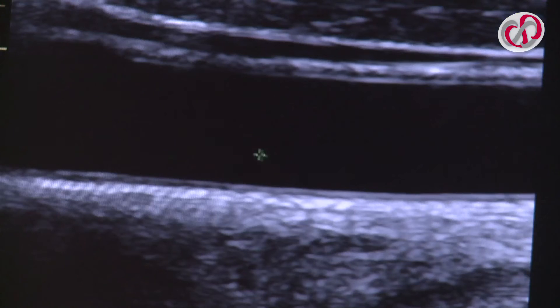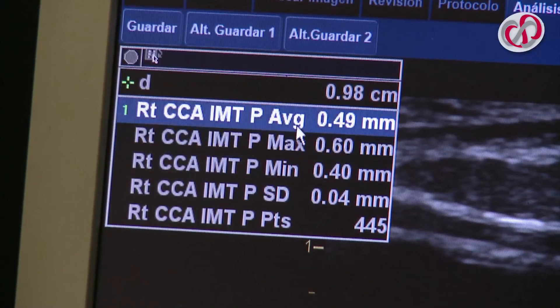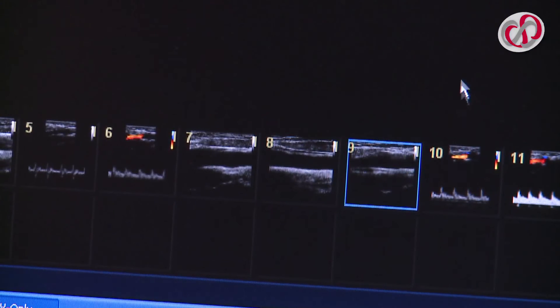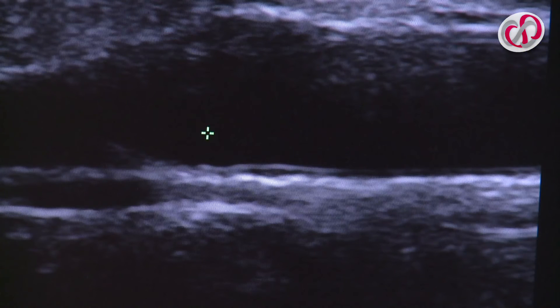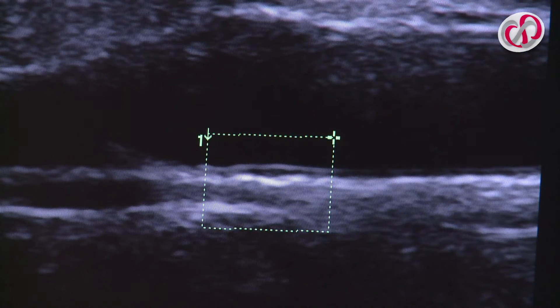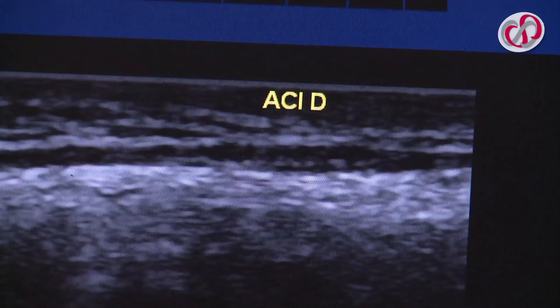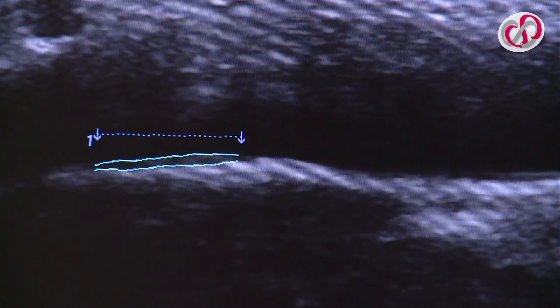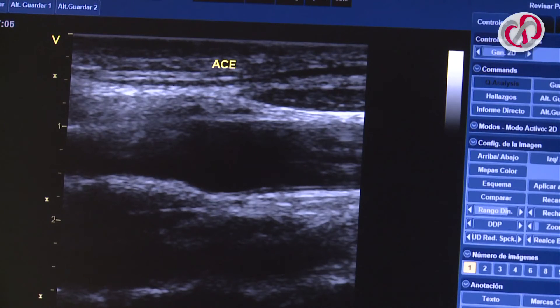Firstly, in the right common carotid artery, select measure and adapt the caliper to the thickness of the posterior artery wall 1cm before the bifurcation, and save. The minimum, maximum, and average values of the measured segment will appear on the screen. The same process is repeated for the bifurcation and the internal carotid artery just at the exit of the bulb. Then check the external carotid artery to assess for the presence of plaques, and repeat the same process for the left carotid artery.